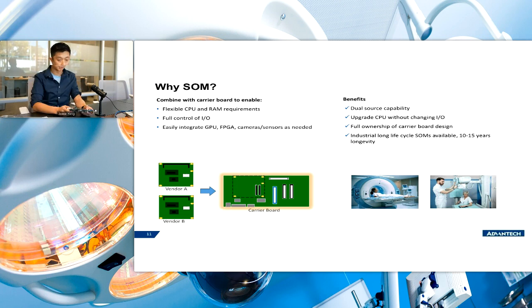Okay, so let's go a little bit further. Why would you want to apply SOM technology for medical imaging? Because it allows you to separate the compute from the rest of your board, it gives you the flexibility to upgrade the CPU without worrying about it changing on you. Also, it allows you to control the design of the I/O fully so that you get exactly what you need.